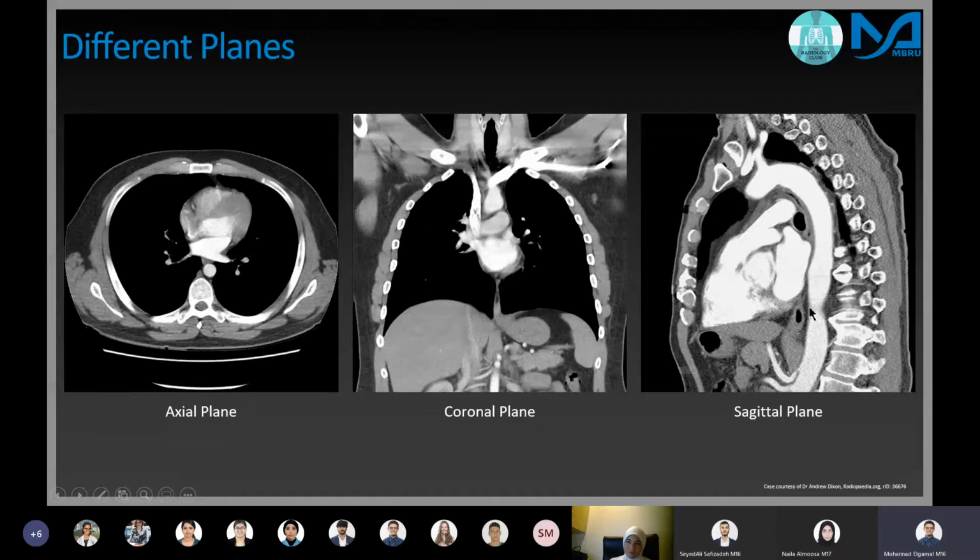So can anyone tell me why it's white after we discussed the whole Hounsfield units concept? Why is this aorta white? What are the things that are supposed to be white, and how come this one is white? If you can jump to the answer, that would be great too. Yeah, we said liquid is usually around 0 Hounsfield units, so it shouldn't be completely white. So in this case, the reason the aorta is white is because this is a CT done with contrast. And contrast is basically a substance that is very dense. It looks like water, but under radiation it shines the brightest. And usually contrast is given to patients to follow the pathway of their vessels and determine if everything is right.